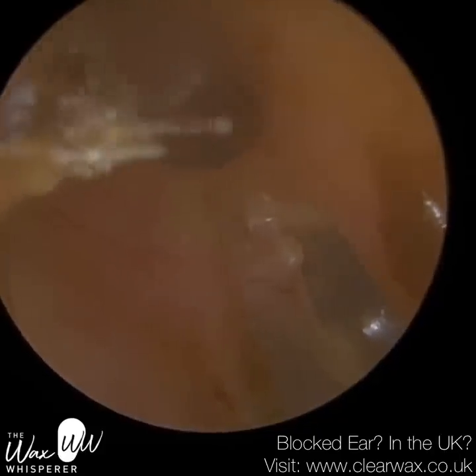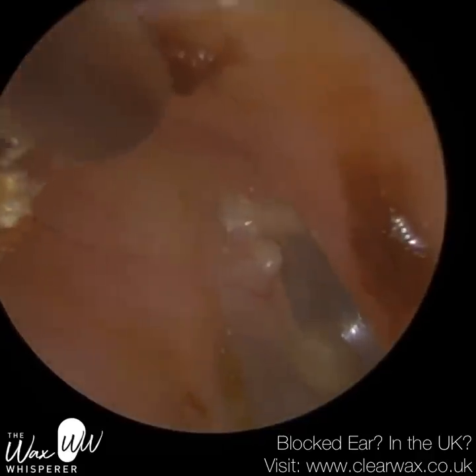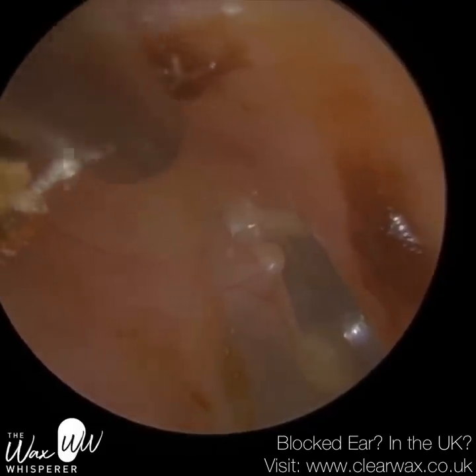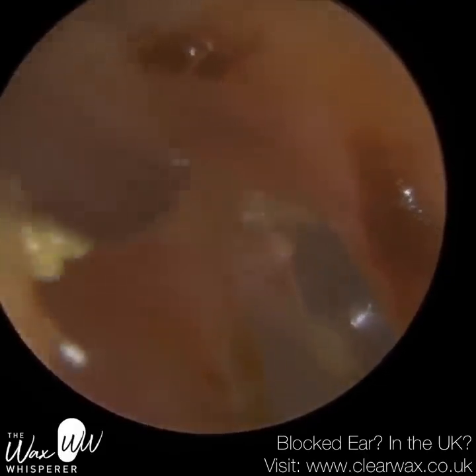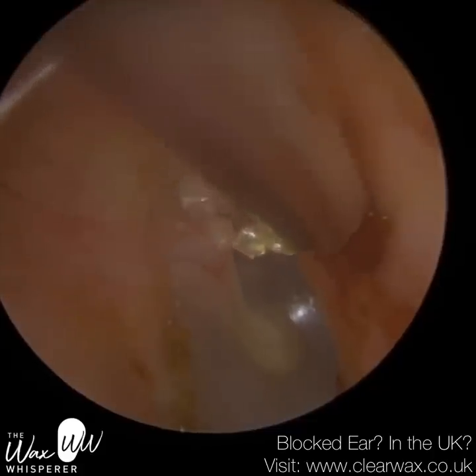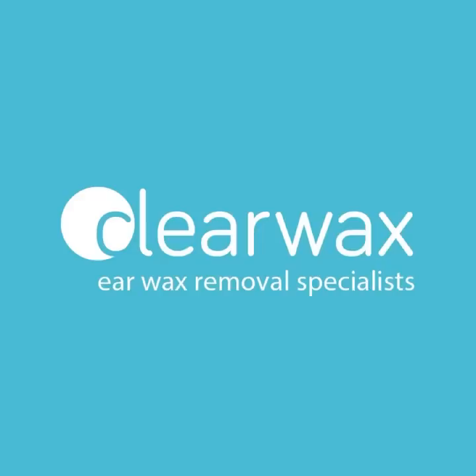What you're waiting for is almost the temperature to rise again in the ear you're performing microsuction in. Let the temperature go back to normal so your brain starts to receive equal messages again from both ears, and the vertigo should resolve. During the procedure, I try to encourage my patients to keep their eyes open and fix on a point — that helps the eyes correct the brain and tell it that you are stationary. Sometimes there's a tendency to close your eyes, and I find that just gets people a bit more dizzy. You can see there's a bit left at the front, but we're not too concerned by that. Well, I hope you enjoyed that video — take care, keep well, speak soon.